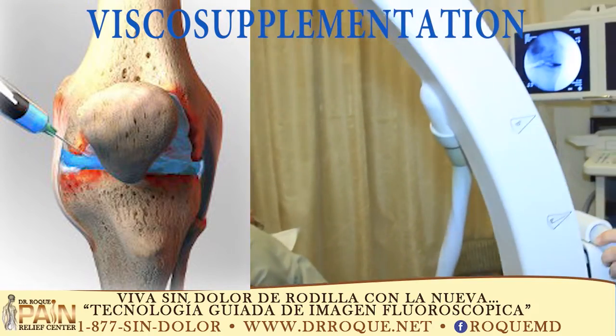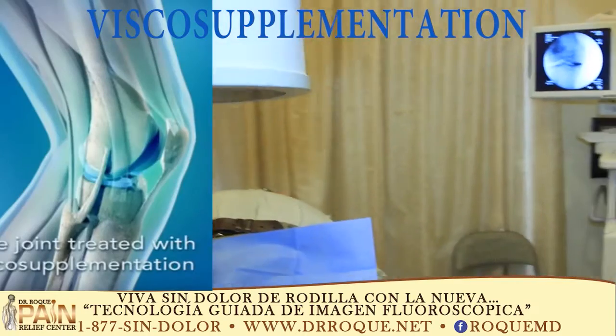Wow, look at that. So it came out perfect. You can actually see the contrast, you can see the needle there.